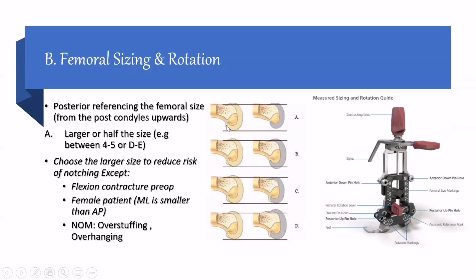This one is the true femur, and here is the component when it is exchanged. And you see that in A there is a downsize without notching, and in B upsizing, and you will see what the differences are between down and up. This will cause an increase in the flexion gap. This will reduce the flexion gap.